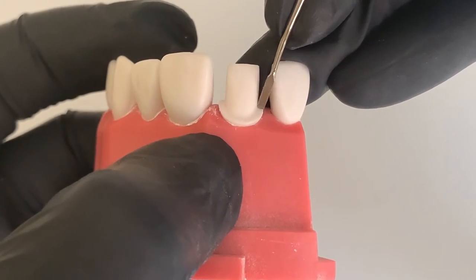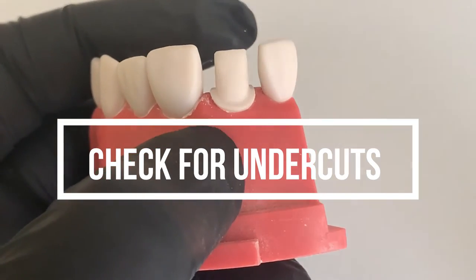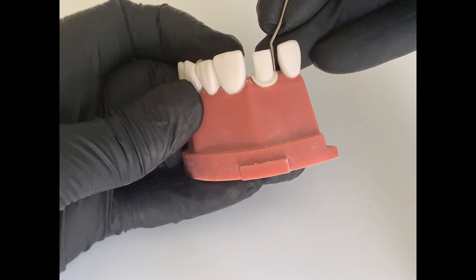The second use is to check undercuts. Lay the enamel hatchet parallel to the axial wall — mesial or distal — and follow the area where the arrow points. That area should be free of any space between the enamel hatchet and the tooth structure. Any space would indicate an undercut, which you then want to remove.